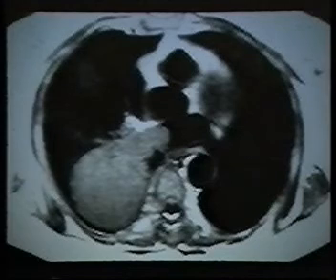We spent 20 minutes fooling around with the EKG leads on this patient, moving them around to all kinds of places, and don't use the standard positions. You can't predict which way you're going to have to put them until we finally got the R wave significantly higher than the T wave, and that's the result once we got decent cardiac gating.